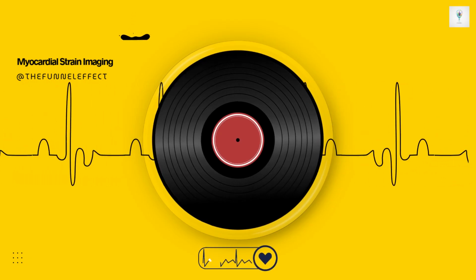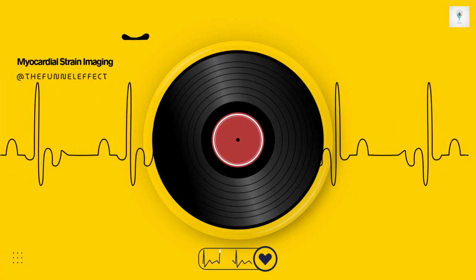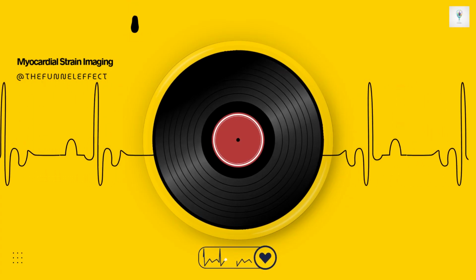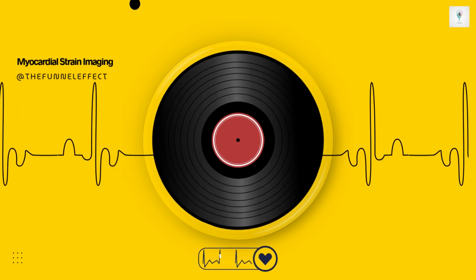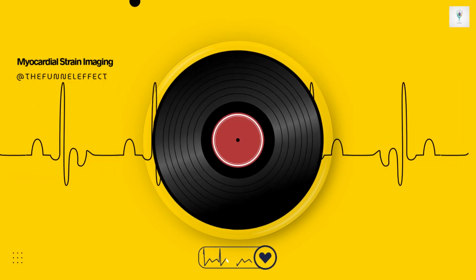Okay. One last advanced metric mentioned is mechanical dispersion. This sounds like it connects the heart's mechanics to electrical stability and arrhythmia risk. Can you explain that concept? Yeah, think about it like timing. In a healthy heart, all the different segments of the left ventricle should ideally start and finish their contraction fairly synchronously, working together smoothly. Like a well-timed engine.